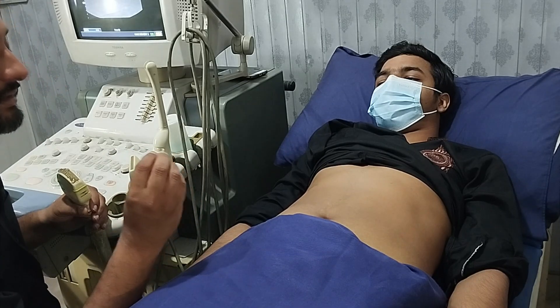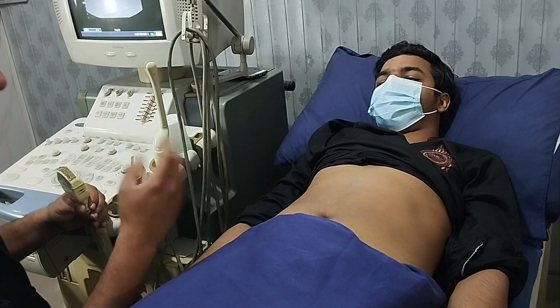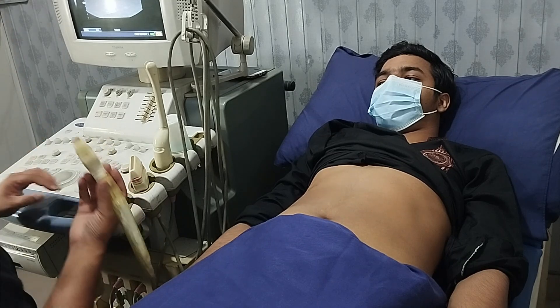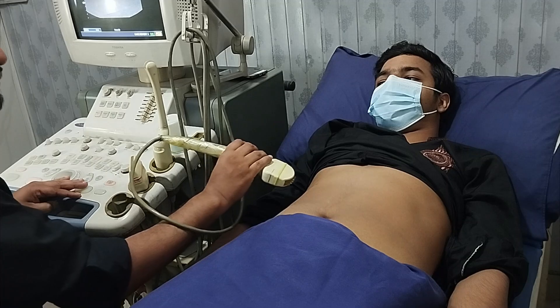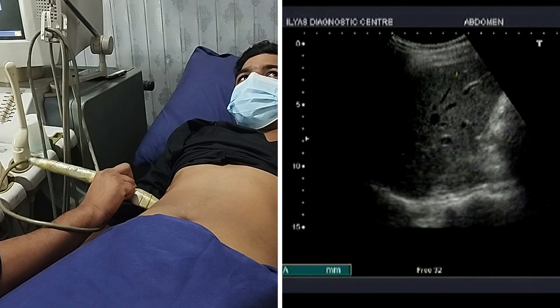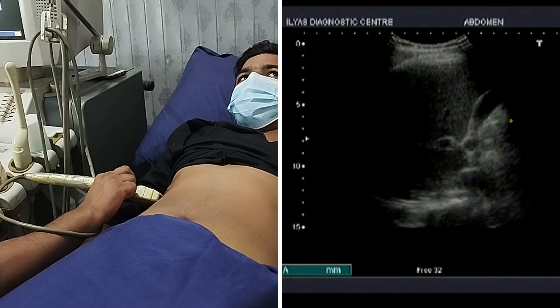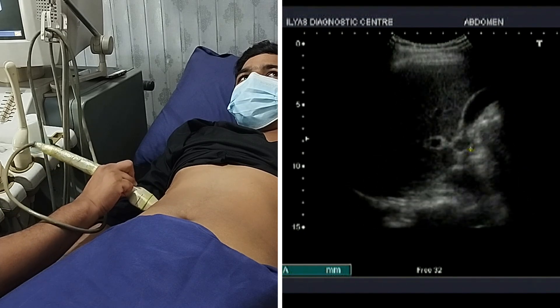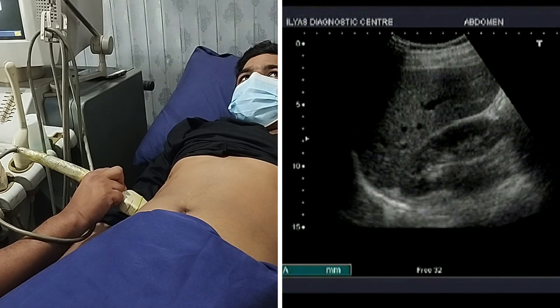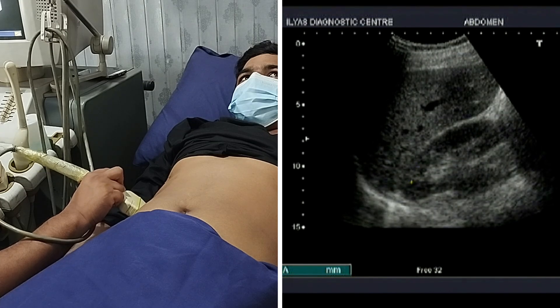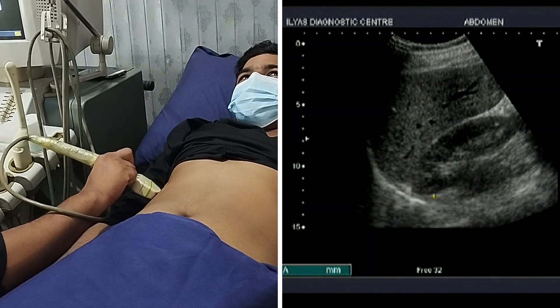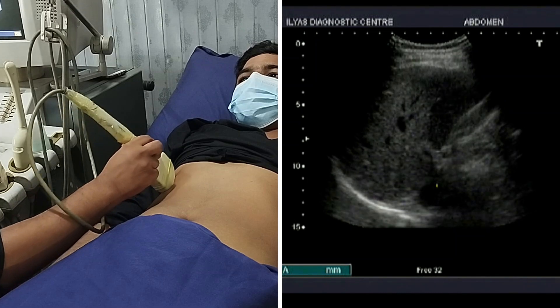I personally like to start with the right hypochondrium. I will put my probe in the right hypochondrium in a horizontal plane — here is the liver. Just by tilting the probe at the same point, this is the gallbladder, and asking my patient to take a deep breath, here is the kidney. I can visualize all three organs in a single plane by placing the probe at the same position and just changing the angle a little bit.